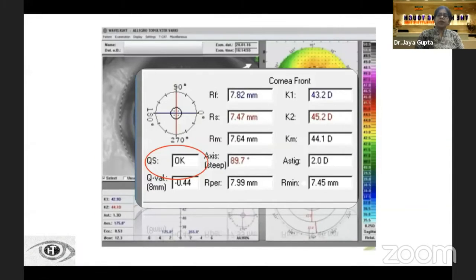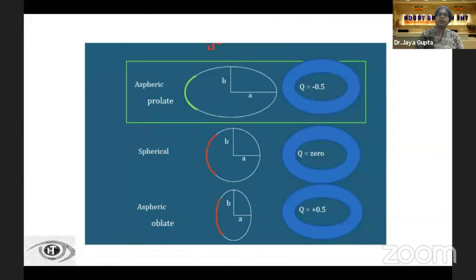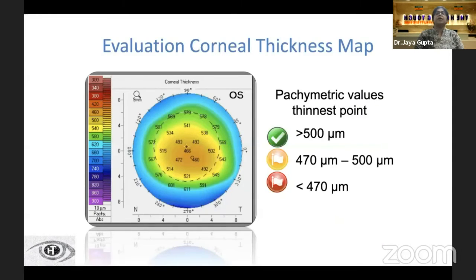We begin by looking at the quality of the scan, which should be okay. Below that, we see the Q value. The Q value is a measure of asphericity of the cornea. Within the central 6 mm zone, the value varies from minus 1 to 0. In a normal sphere, the Q would be 0, whereas in a normal cornea, which is prolate, the value is negative. After myopic ablation, it becomes oblate and the value becomes positive.